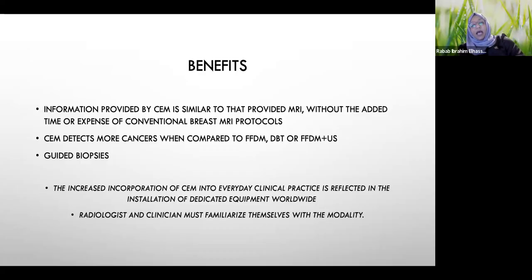when compared to tomosynthesis, and when compared to mammography plus ultrasound together. And probably you have heard about the BRAID trial, the UK trial that was published in May, I think, where they compared all imaging modalities in the dense breast, and the results were very encouraging, that actually contrast enhanced mammogram and abbreviated MRI protocols both can detect many more cancers than the other conventional modalities, even combined.